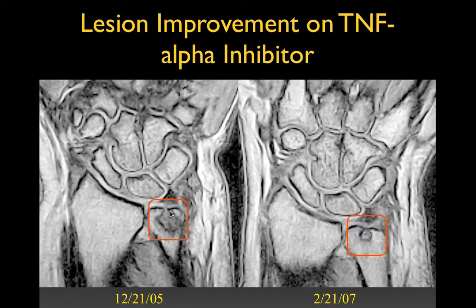When you treat it, you get rid of the inflammation. The area where you still have trabecular bone becomes normal again, just like we talked about. But where you've completely destroyed the trabecular bone, it's not normal. It's irreversible. We found in the study that Oren Traum and I published a number of years ago in J. Rheum that about 15% of patients, once they were started on a TNF alpha inhibitor, showed a substantial decrease in erosions. Most of them didn't go away, though some of them did. Most of them just got better. But I think what's happening is that we're basically preserving that penumbra of injury. And therefore, as you can see, the sooner you catch it, the more bone you're going to preserve.